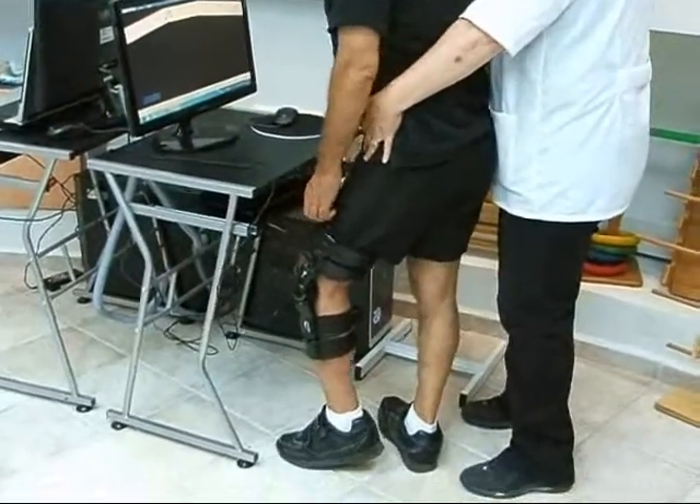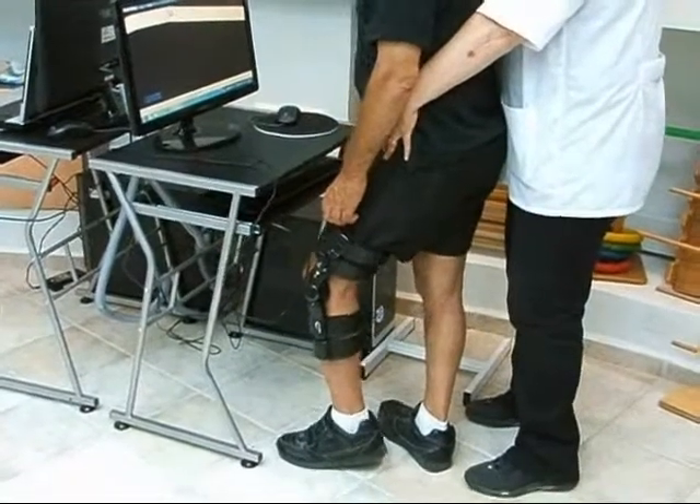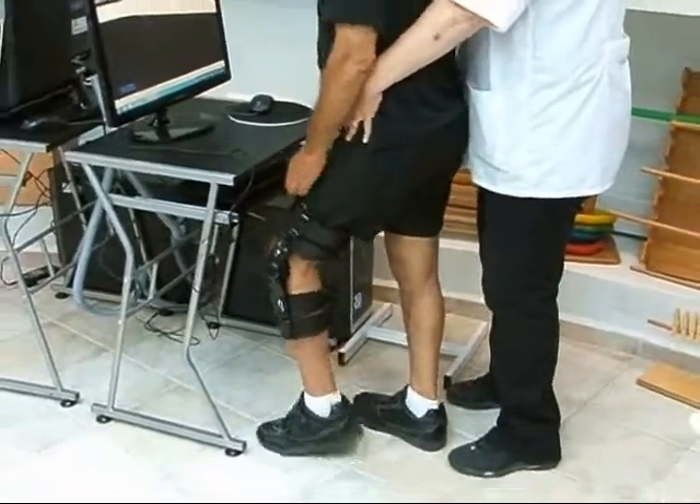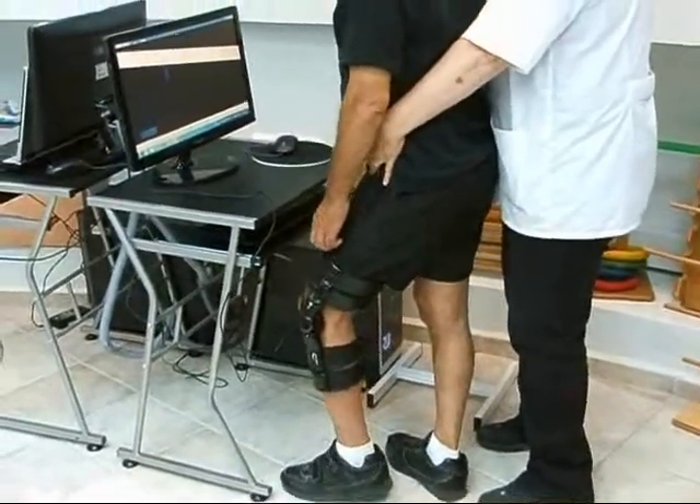The patient can use the Leg Tutor in the clinic and the home care environment, and the Leg Tutor system provides objective and quantitative evaluations on the patient's treatment progress.